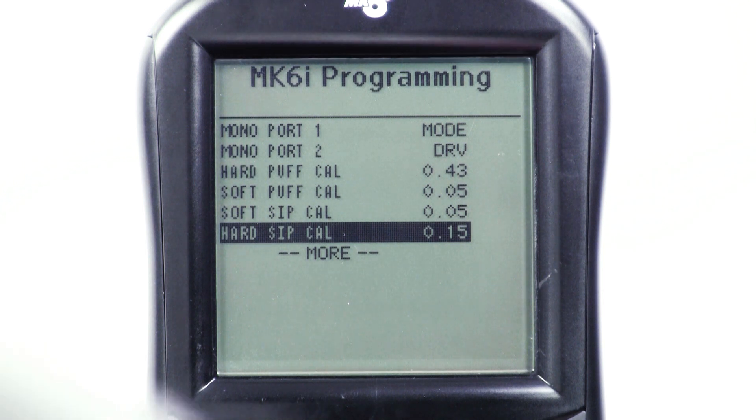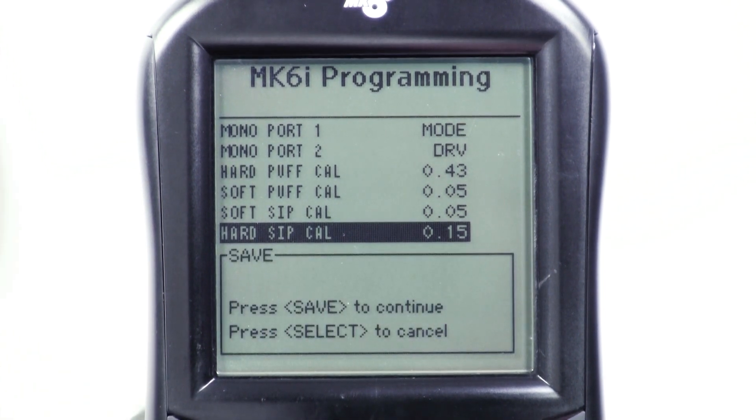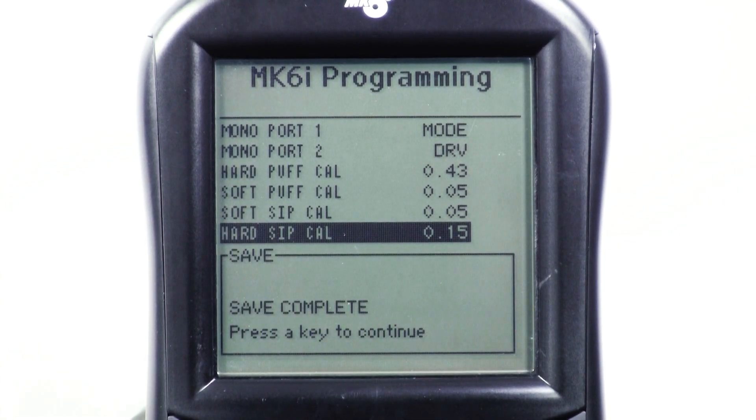When you're finished, remember to press save, then press save again. Now pat yourself on the back — you've done it.